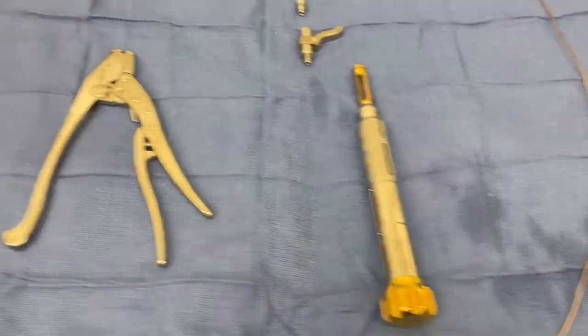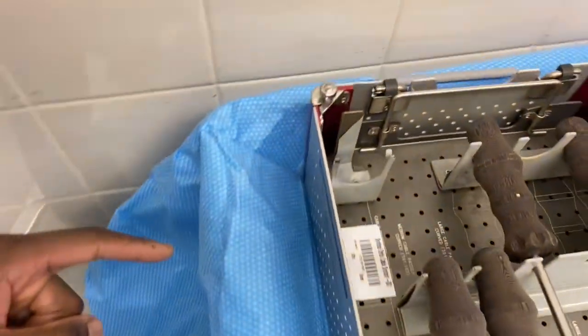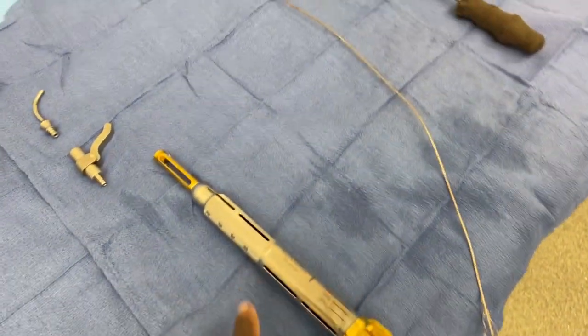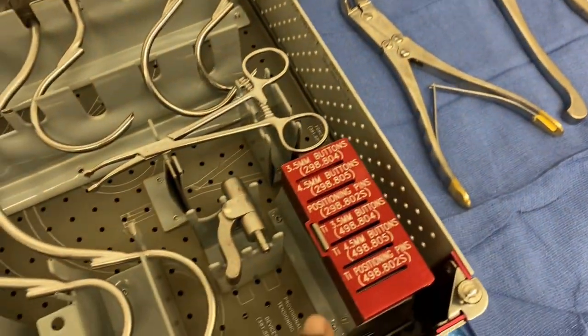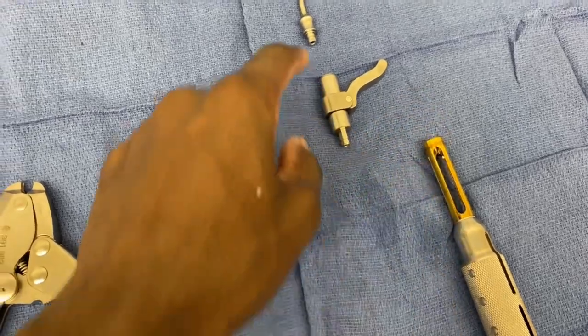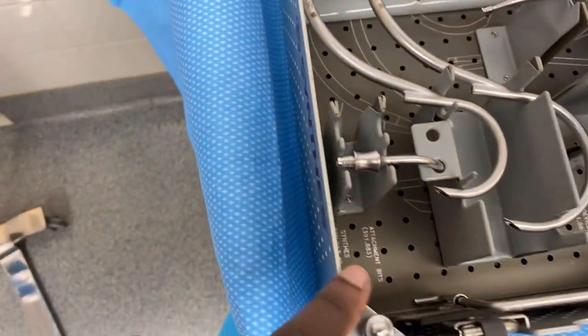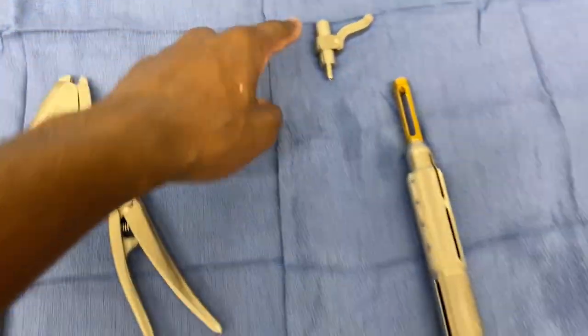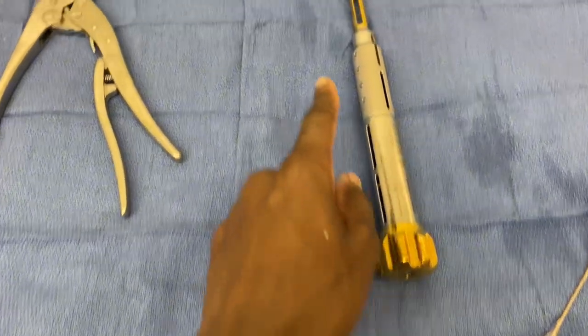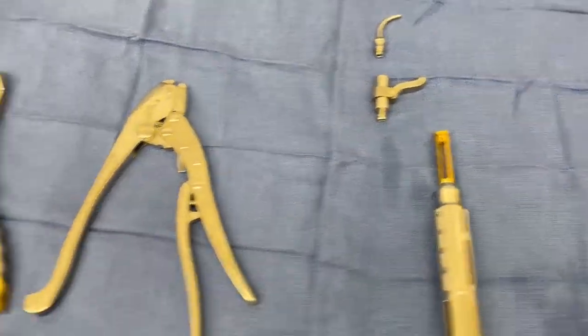That right there is called a cable tensioner. You take the cable tensioner along with one of the tensioning pieces — this goes right into here — and then the attachment bit will go right at the top. They'll feed the cable right through the back here and tighten it up.